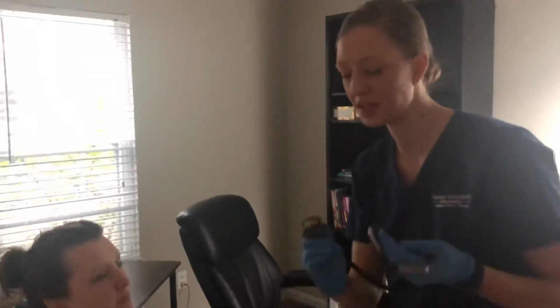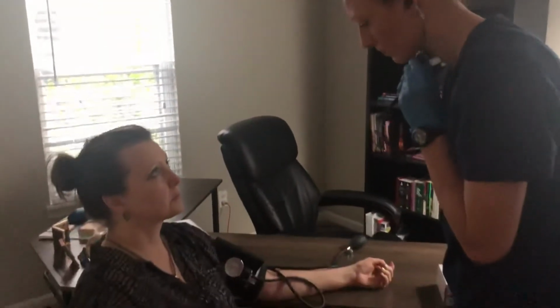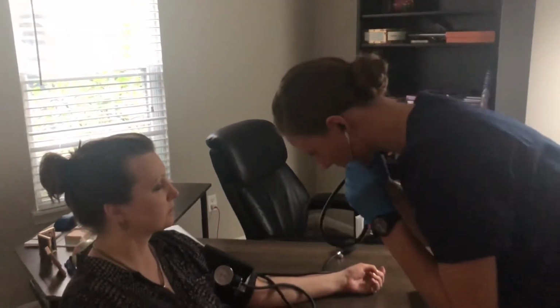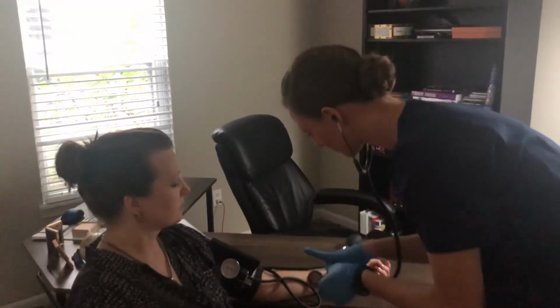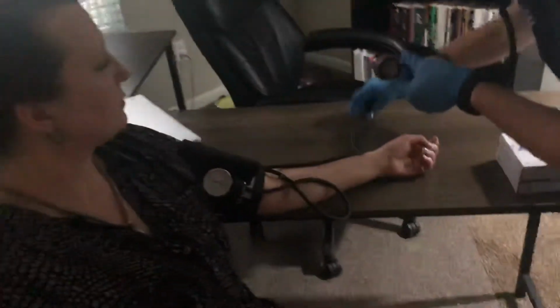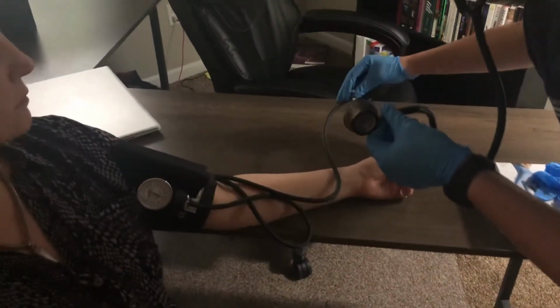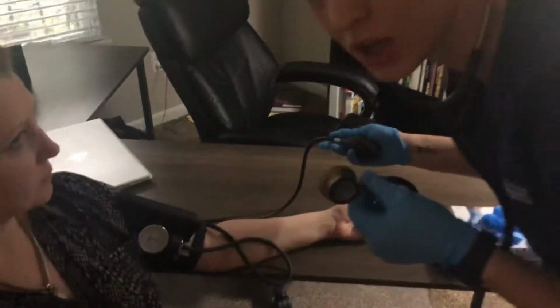So I'm going to be doing the two-step method. This will be done with me using the Littmann stethoscope to listen to her brachial pulse, and that will help me determine how far to inflate the blood pressure cuff so that I can reduce harming my patient. The needle is at 0. Okay, I'm going to pump up the blood pressure cuff. The valve is closed.